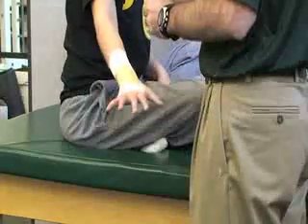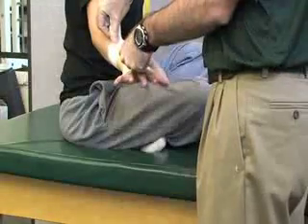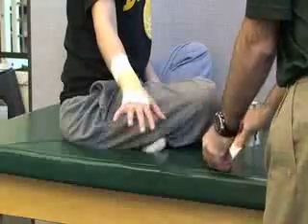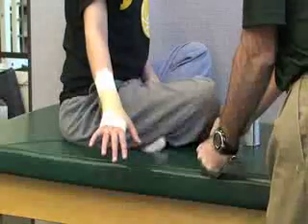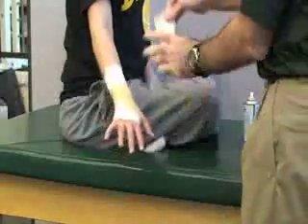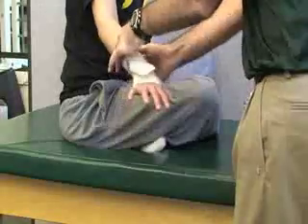What you can do is measure the tape — you can do this on the patient or on the table. You're going to do a form of X pattern just like we did on the elbow and the foot, measuring from the top to the bottom. I like to do four pieces: one straight and then the X. Attach this to the upper part first.